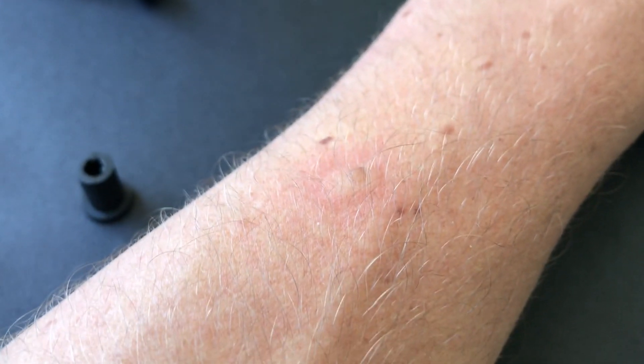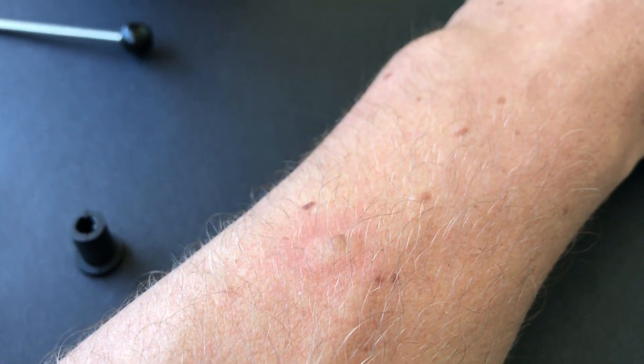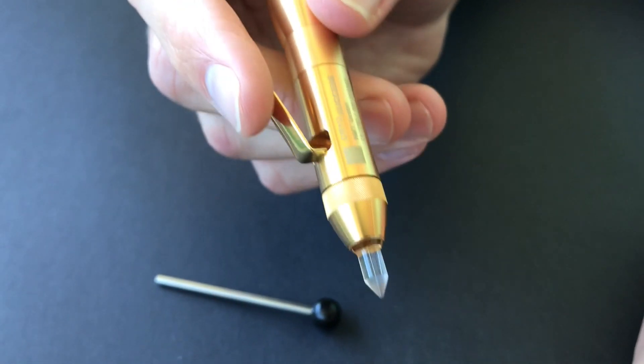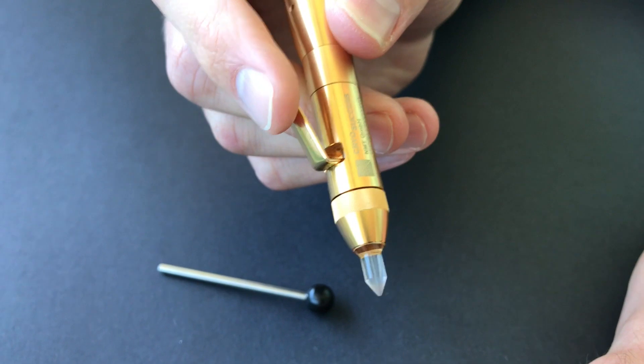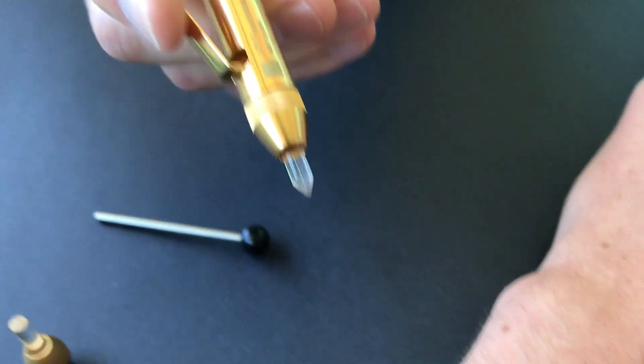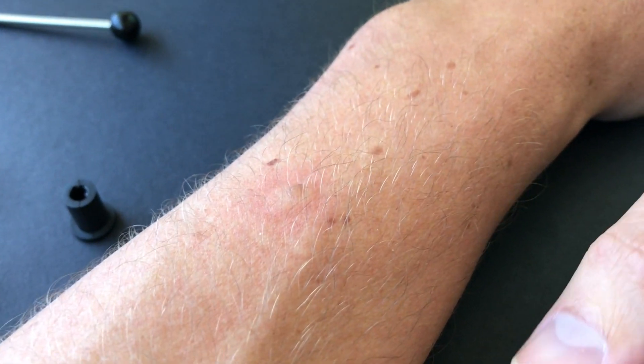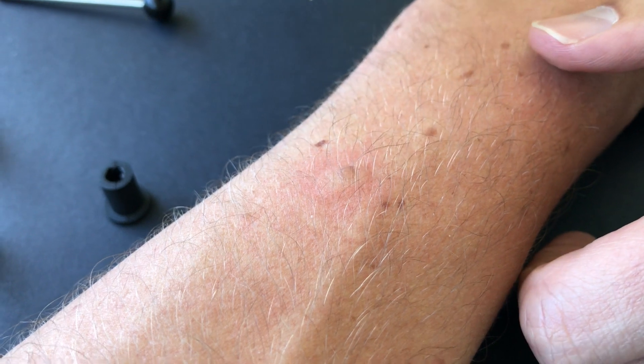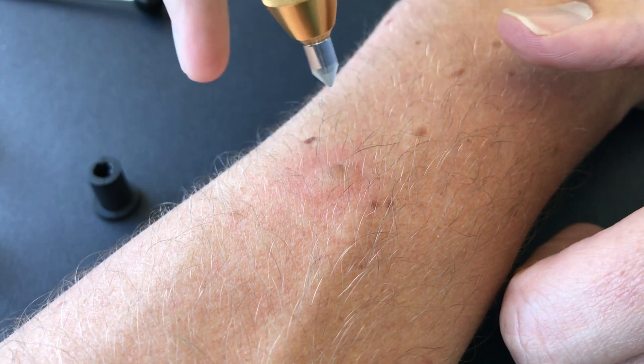As mentioned before, I'm going to demonstrate the use of the cryo success on a common skin lesion. In terms of holding the product, I use it just like I would a pen, holding it like that with my index finger on the trigger. The main advantage of the cryo success is that you're applying direct pressure to the lesion.